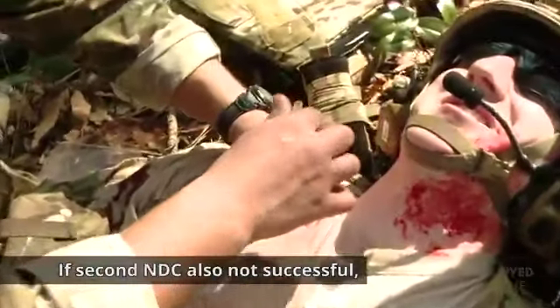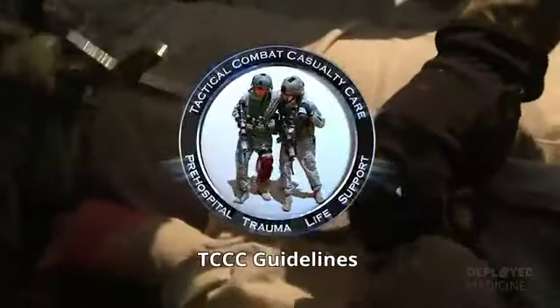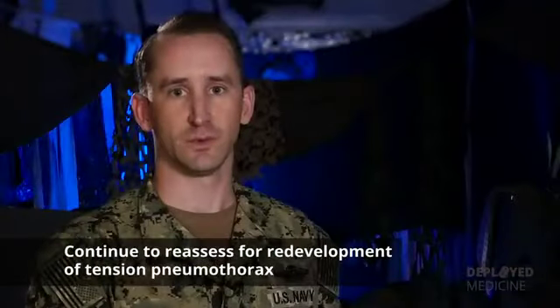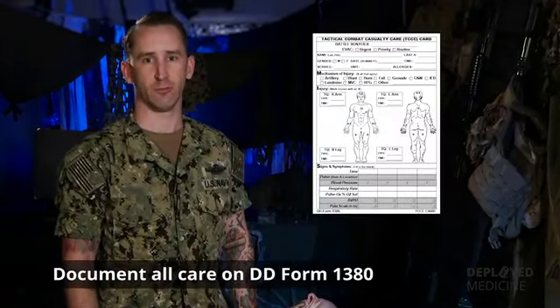If the second NDC is also not successful, continue on to the circulation section of the Tactical Combat Casualty Care, TCCC, guidelines. Continue to reassess for redevelopment of a tension pneumothorax and document all care on the DD Form 1380.